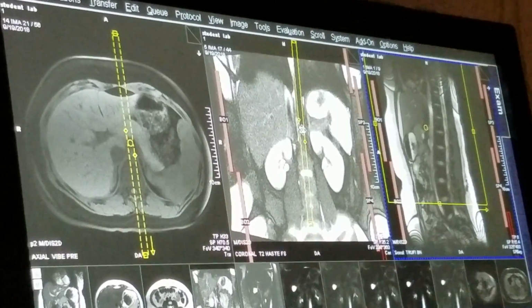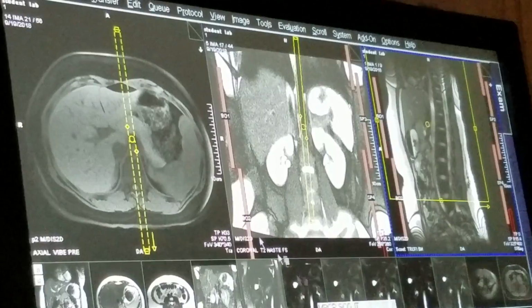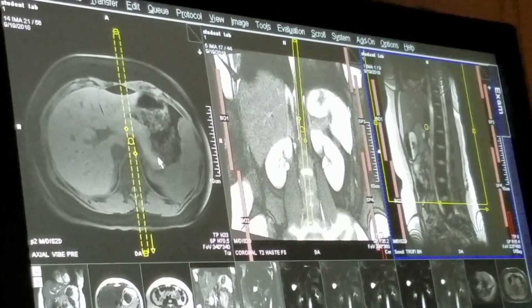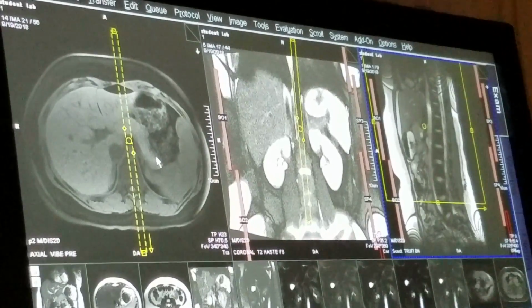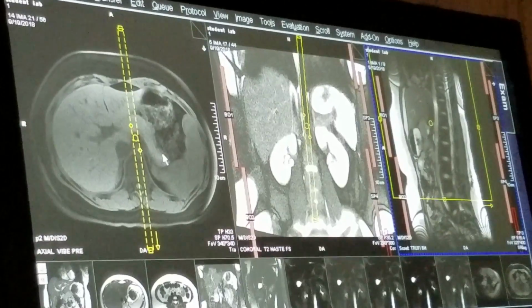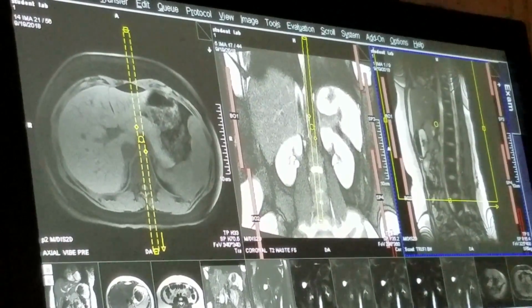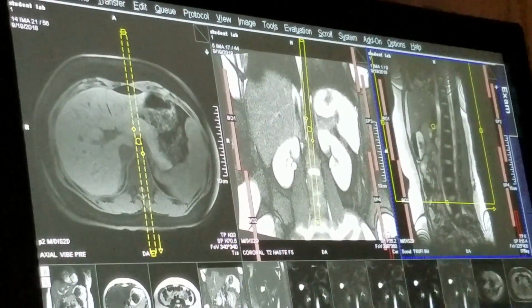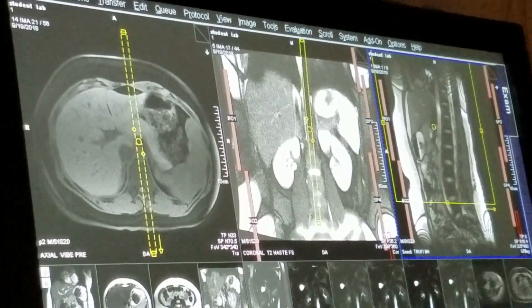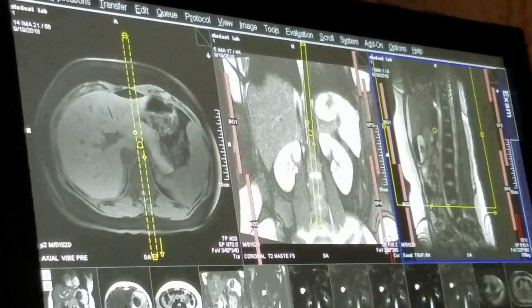This scan, however, is not scanned on isocenter. It's scanned on fixed table position. Because right now, we don't want the table to move between the pre-contrast scan and the post, because then it will attempt to readjust and tune and shim, which you'll completely miss your bolus. So the care bolus is always scanned on a fixed table position. So it's going to scan right where the table is right now. So this might be distorted because it's not anywhere near isocenter, but we'll still be able to see it. Does that make sense?